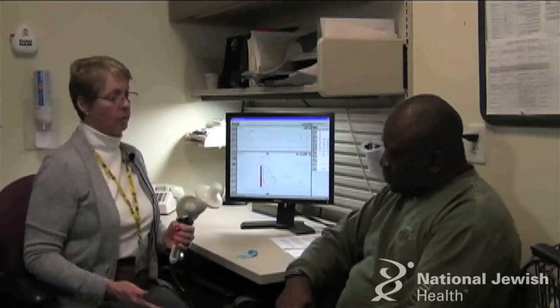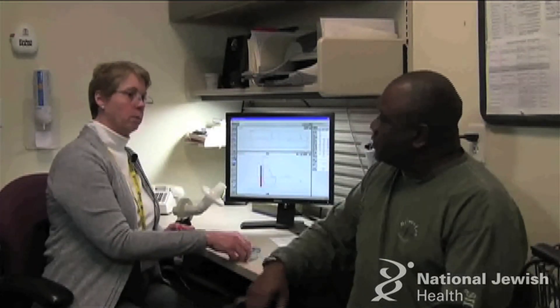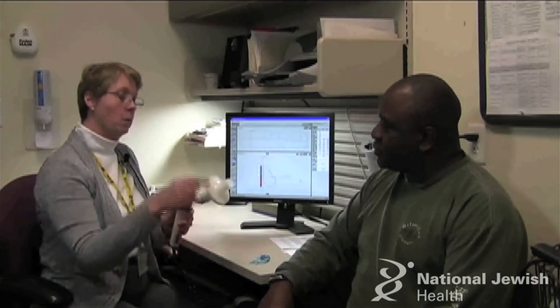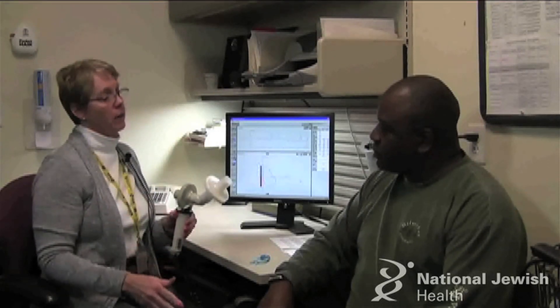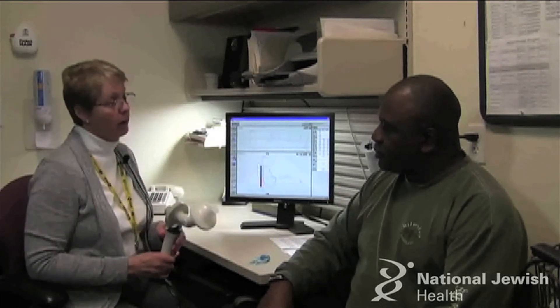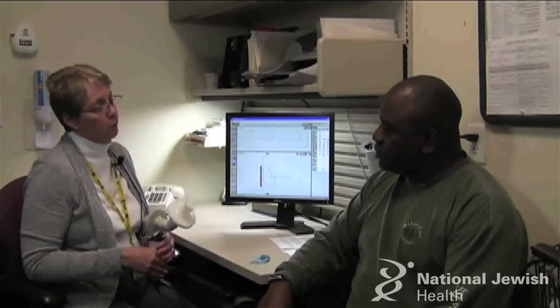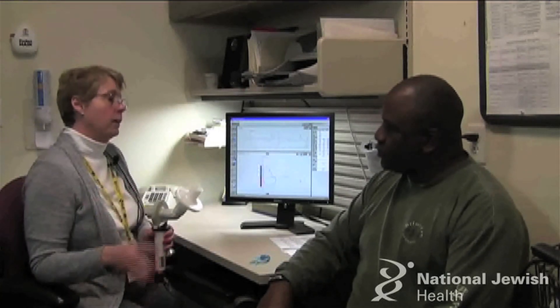How we do this test is by sitting up nice and tall in the chair, making sure both feet are on the floor, and then you'll put nose clips on your nose. Then you'll put this portion of the mouthpiece in your mouth past your teeth. Get a good seal with your lips. Make sure your tongue's not in that hole. Then I'll have you take two normal breaths in and out, then a big breath in and blast it out hard and fast. Keep blowing until I ask you to breathe in and come off the mouthpiece. I will coach you through each step of the process, so just listen to me and relax and you'll be fine.